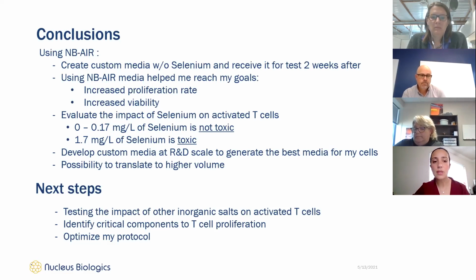For next steps, I will be testing the impact of other inorganic salts. I don't know if you remember when I was setting up the experiment, under inorganic salts there was sodium selenite, but there was also lithium chloride. So for the next step, I might test the impact of lithium chloride on cell activation and cell proliferation, which will allow me to identify the critical component for each CQA, and then help me optimize my protocol.